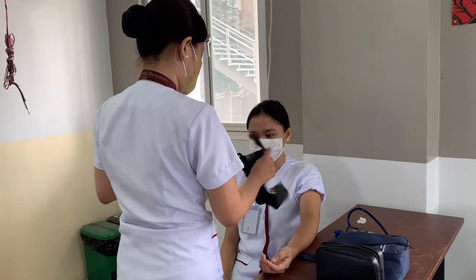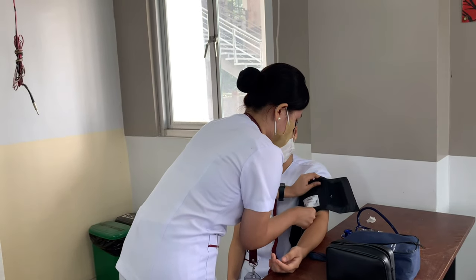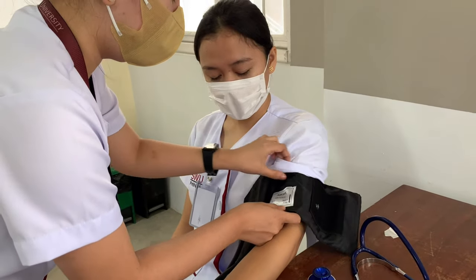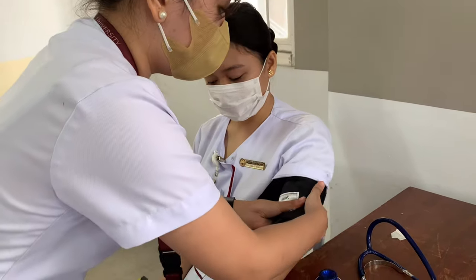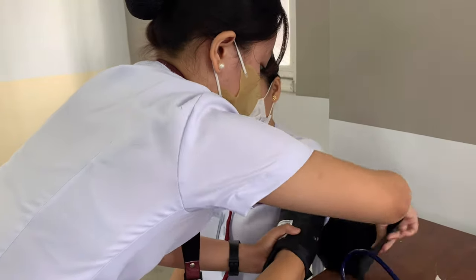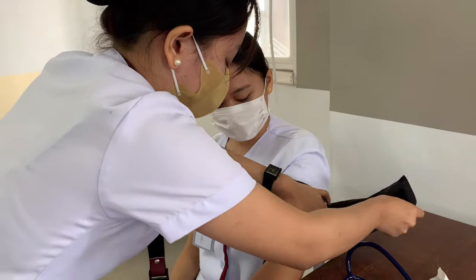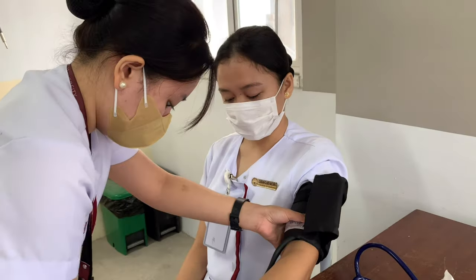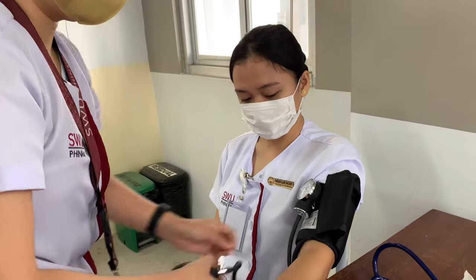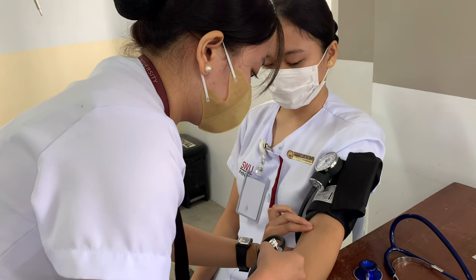Blood pressure increases when the arm is below the level of the heart and decreases when the arm is above the level of the heart. Position the manometer gauge at eye level to ensure an accurate reading. Palpate the brachial artery or radial pulse by pressing gently with the fingertips.